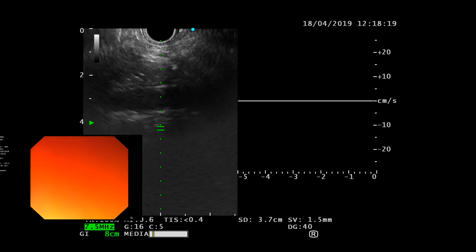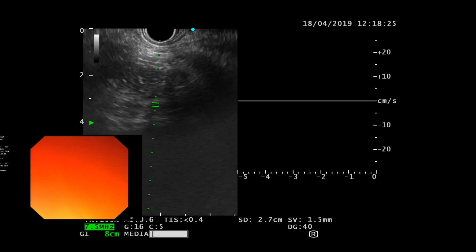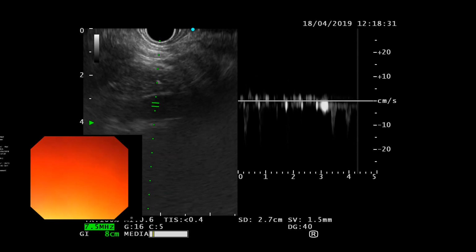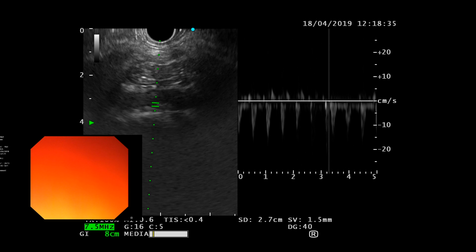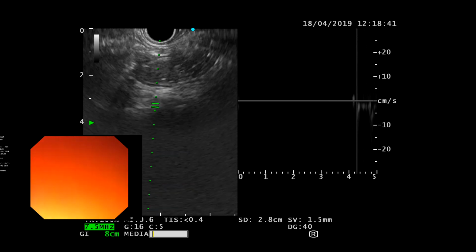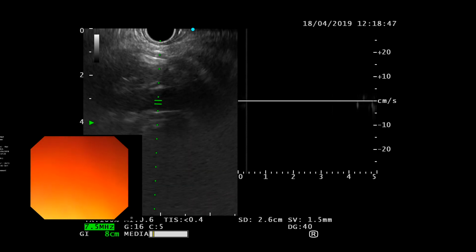power flow here. And basically, how do we move those two lines? How do you adjust them? To be placed on the artery, how do you move that? Once you put it on, you can go up and down with the roller. It moves with the roller. And then secondly, you can also widen the window on those lines.